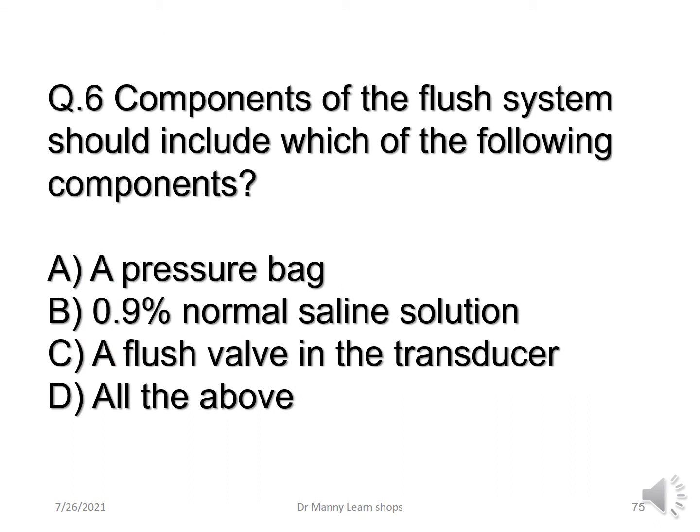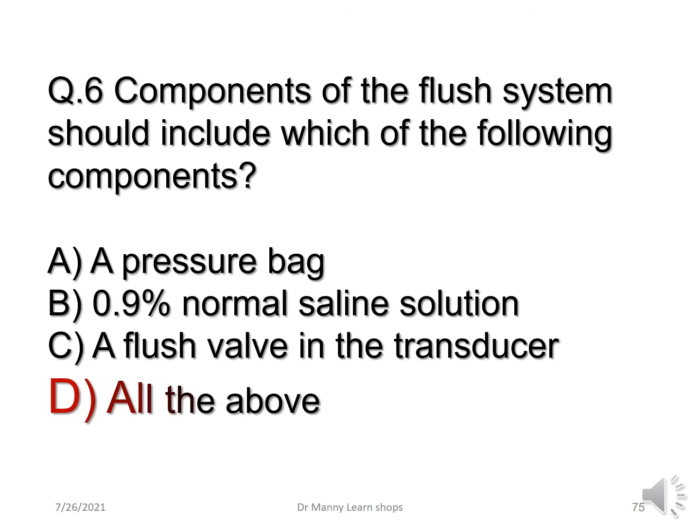Components of the flush system should include which of the following? A pressure bag, sterile normal saline solution, a flush valve in the transducer, or all of the above? The correct answer is all of the above.